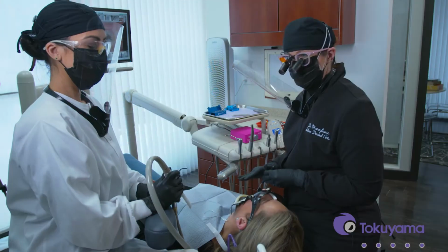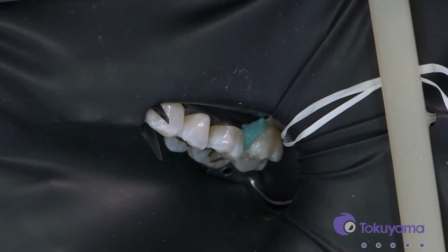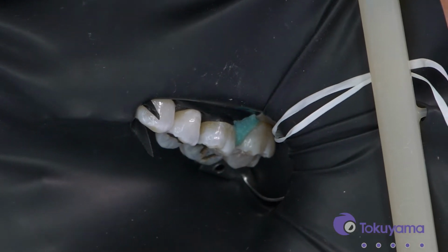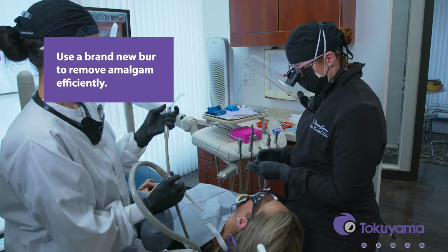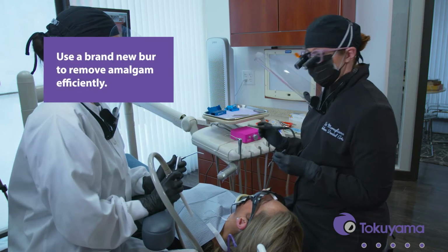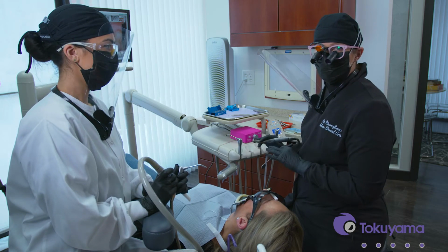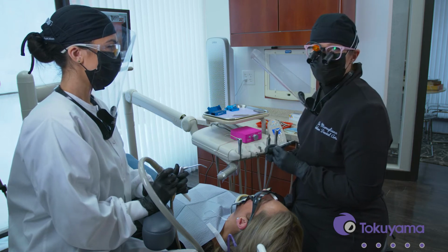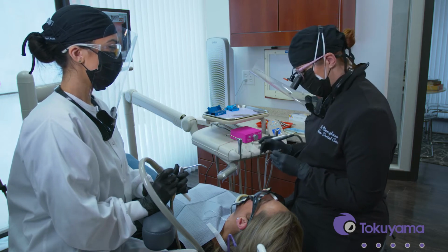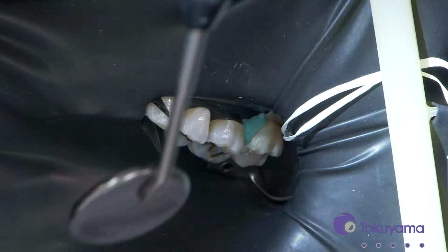We've got our rubber dam in place. This is real life, so we had to use a little bit of liquid dam to cover a little void in our rubber dam, and I'm ready to get started. One of the best things that we can do to remove amalgam is use a brand new burr. It will help you cut the tooth efficiently, get rid of the amalgam quickly, and also make sure that you can remove caries as cleanly and smoothly as possible. So let's get started.